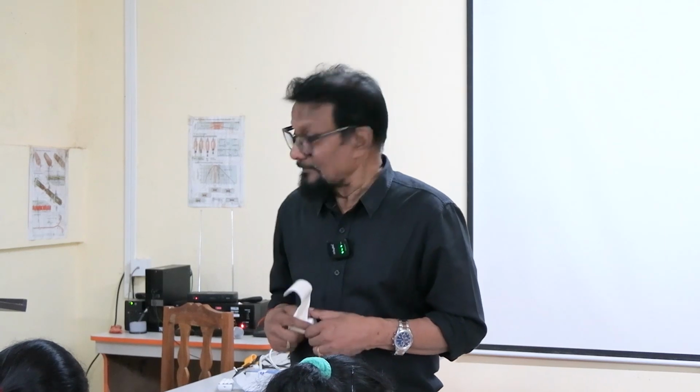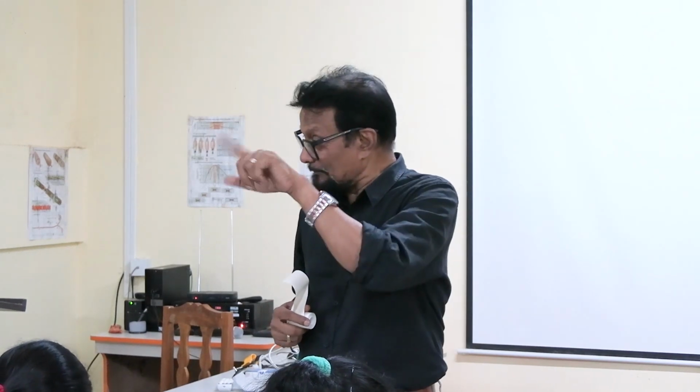That is, 1 millimeter means how much time? Exactly. How can you get this value? 1 second by 25 is 0.04 only.